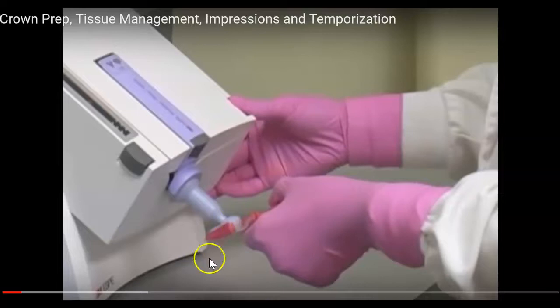What this dental assistant is using here is what's called a triple tray.